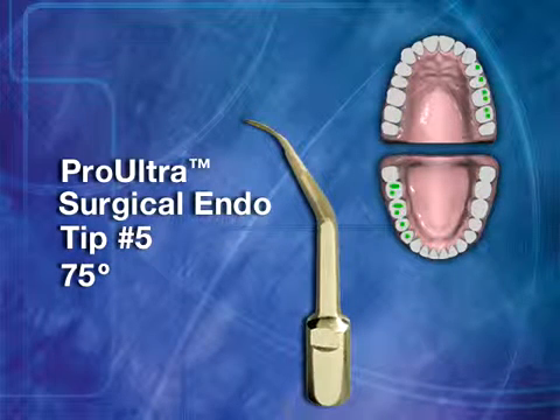Surgical Tip No. 5 has a 75-degree tip angle. This instrument is used in buccal roots of mandibular right and maxillary left posterior teeth.